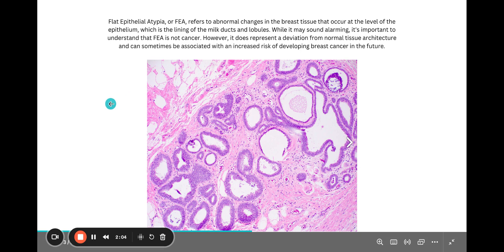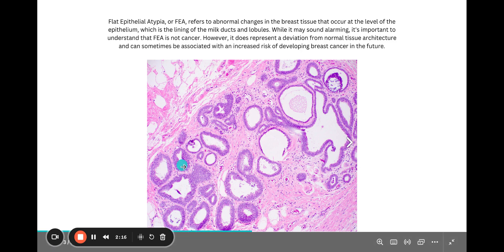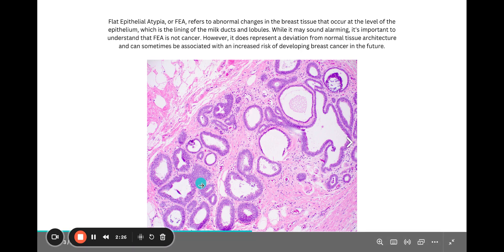So you can see here at low power what we have is the lesion here. And you can pretty significantly understand and see why it looks different, because it doesn't have that nice, tidy two-layer thickness that we were discussing in the normal slide. It looks very proliferative and strange. The reason why it's called flat epithelial atypia is because the lesion kind of looks flat at low power.